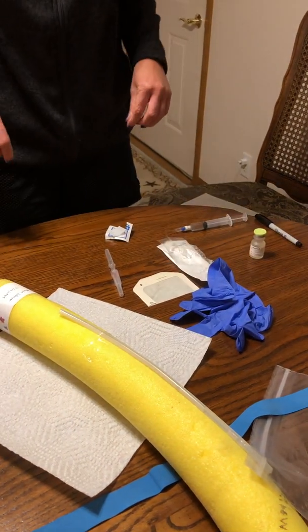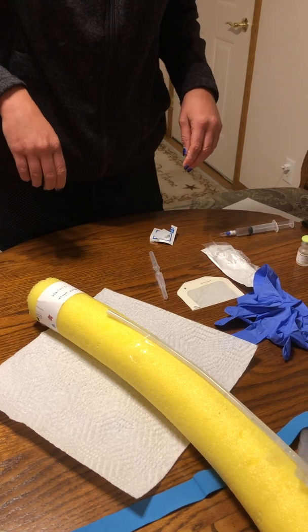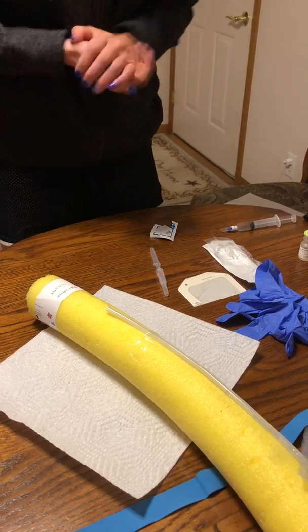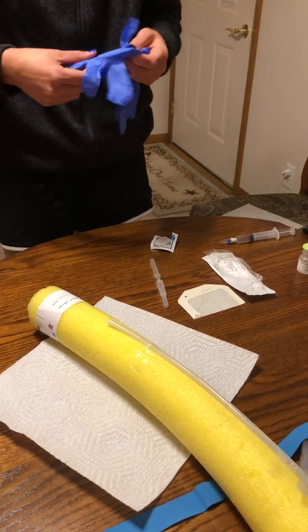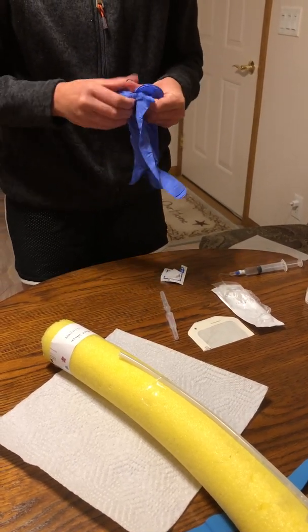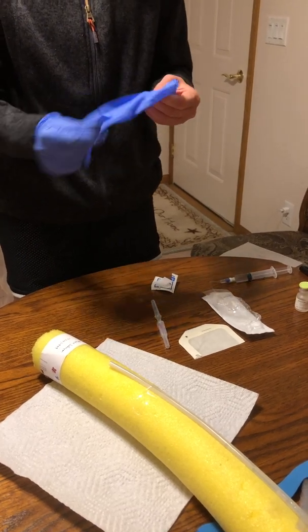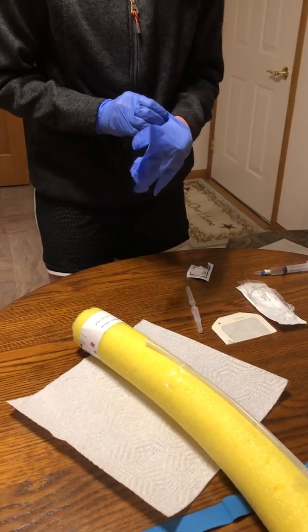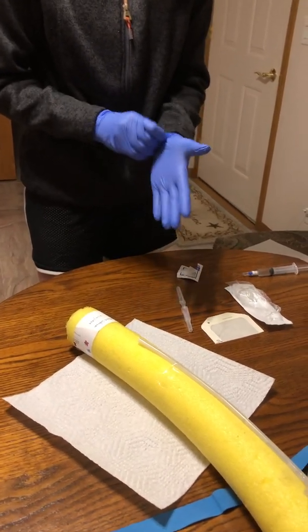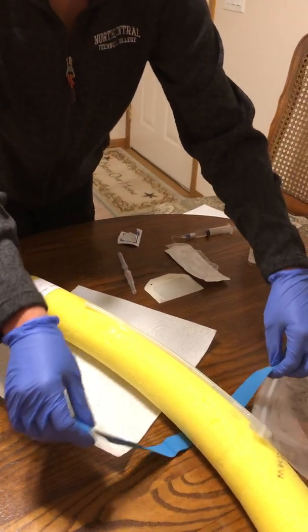So next, what I'm going to do is wash my hands, and then don my gloves. Now I'll apply my tourniquet.